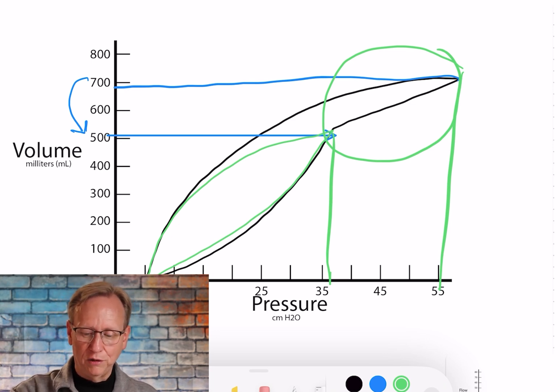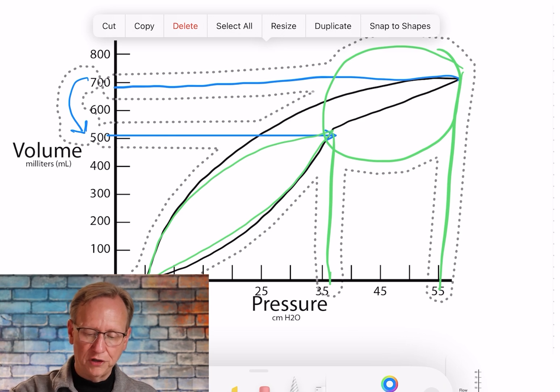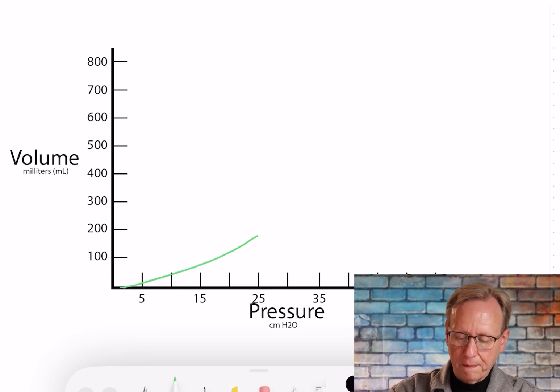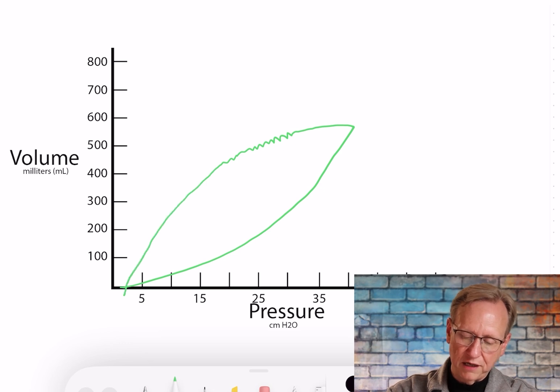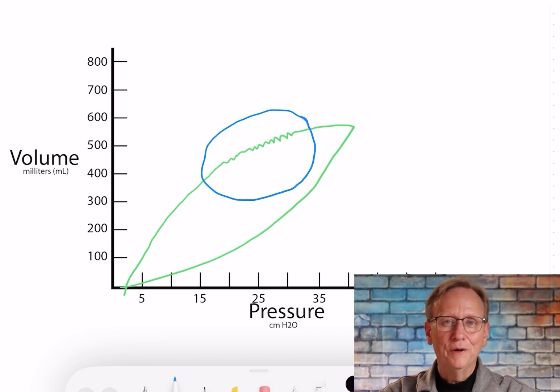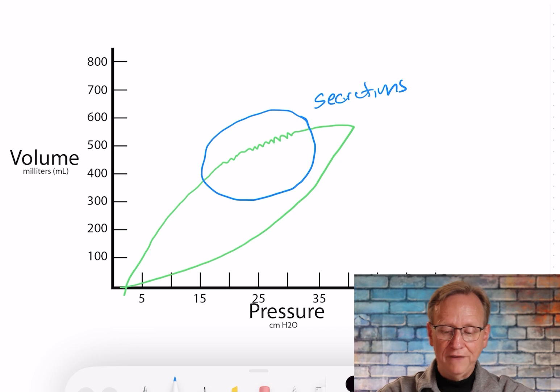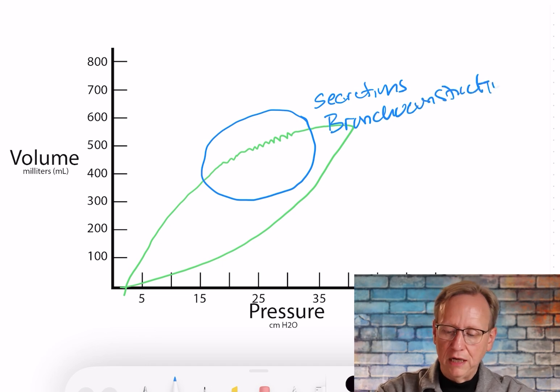One more thing: you can look at the edges of the graph to determine additional information. During exhalation, if you see a little jaggedness or flutter along the back part of the loop, that indicates some kind of flutter during exhalation — likely secretions, which means you probably need to suction the patient. If it's a very fine flutter, it could be bronchoconstriction, in which case you should give a bronchodilator.